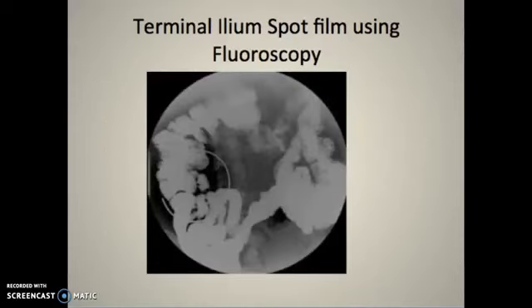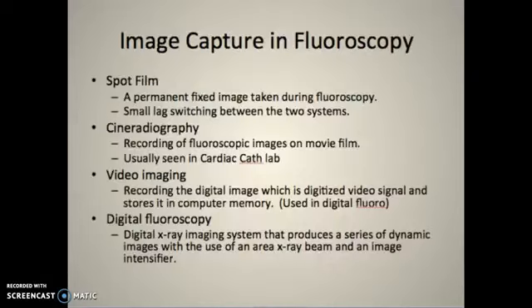So here's an example of a terminal ileum spot film that a technologist would be asked to do. We're going to go deeper into this in further lectures down the road. I think it's week 3 or 4.